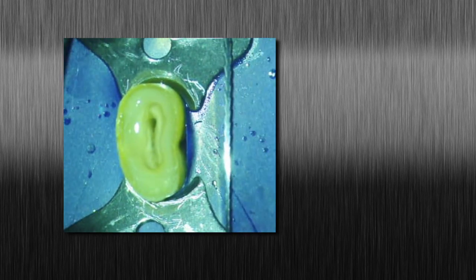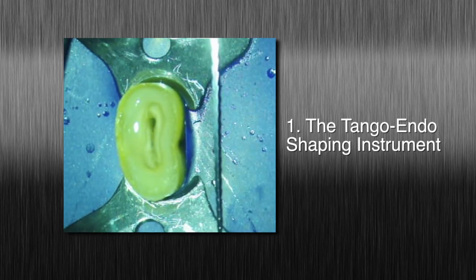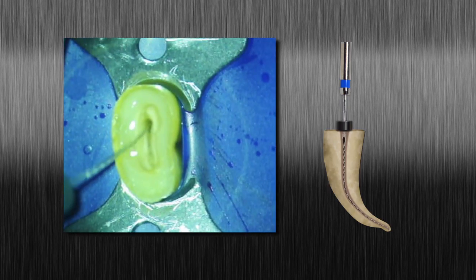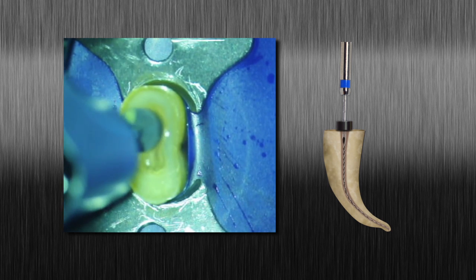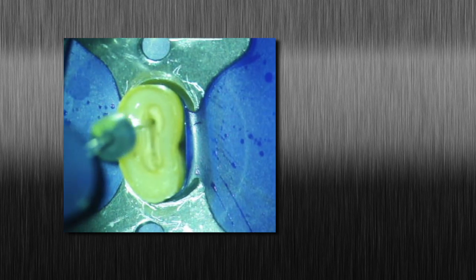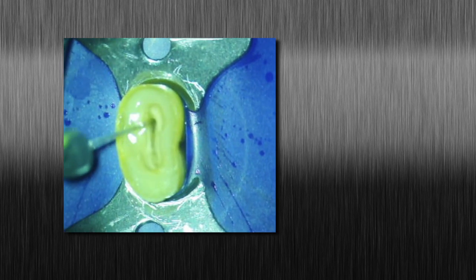In the presence of irrigant, follow along the glide path and shape the wider extensions of oval canals with the Tango Endo shaping instrument. The Tango Endo shaping instrument has a single blue band on the latch head. Use a gentle inward pecking motion with short 2–3 mm amplitude strokes until the working length is reached. Clean the flutes frequently during instrumentation and inspect for unwinding or abnormalities.